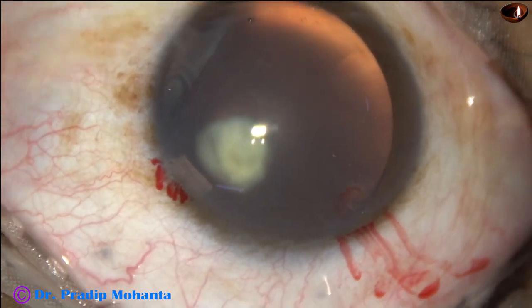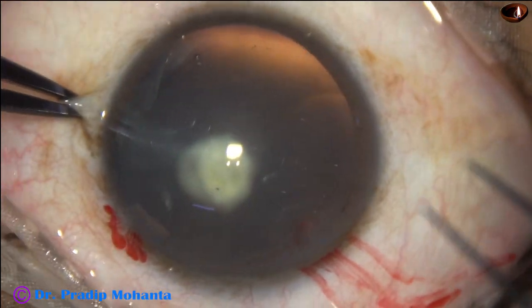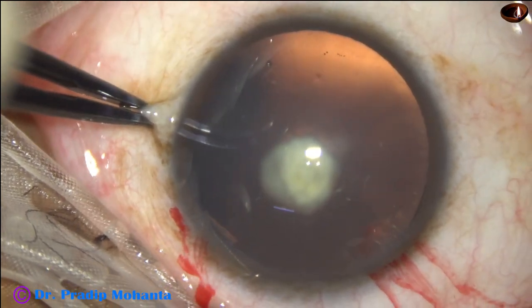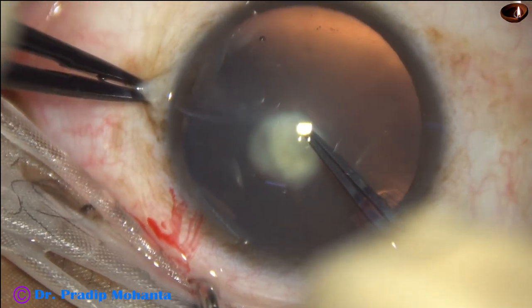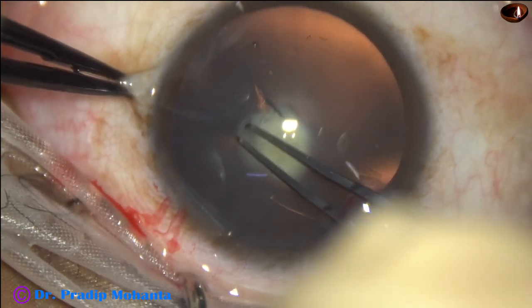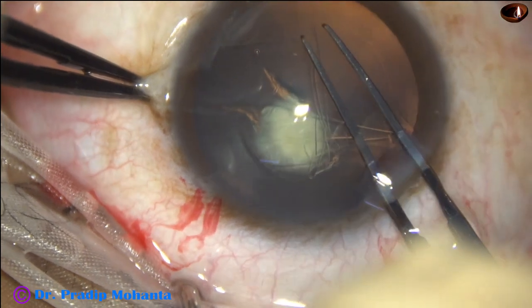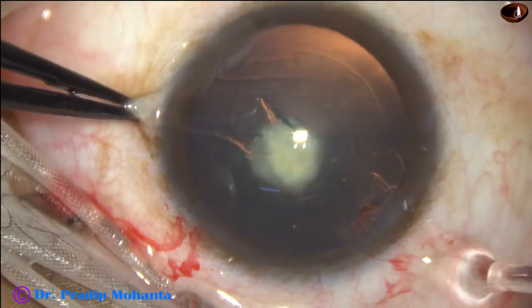And now, capsulorhexis. Capsulorhexis is being done with a utrata forceps. The utrata goes in with closed prongs, makes a puncture at the center, goes towards 3 o'clock. A capsular tag is raised. This capsular tag is guided anti-clockwise to get an adequate size of about 5.25 millimeters.